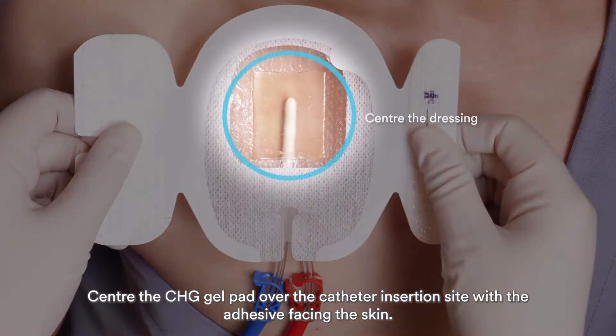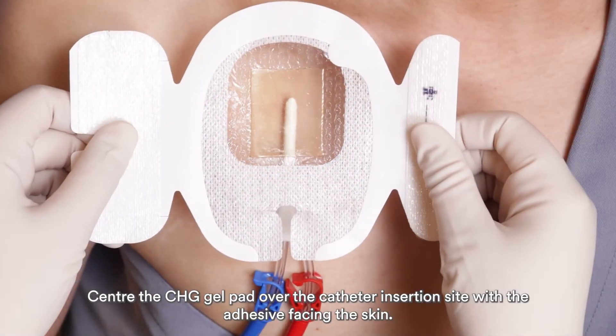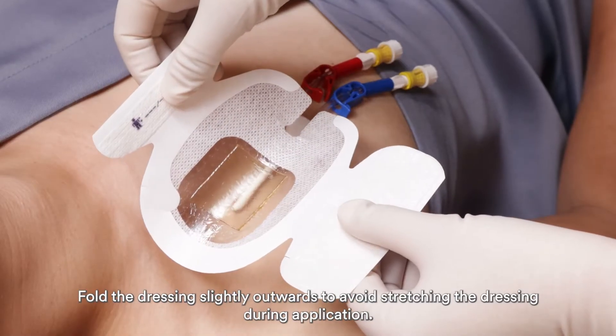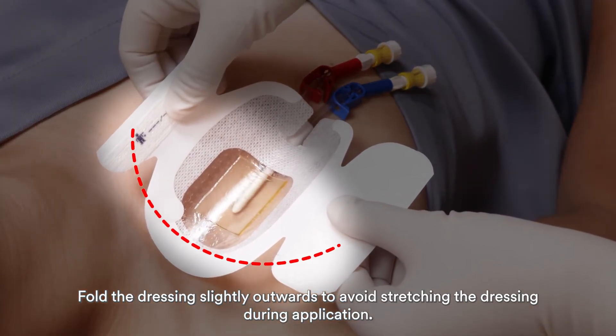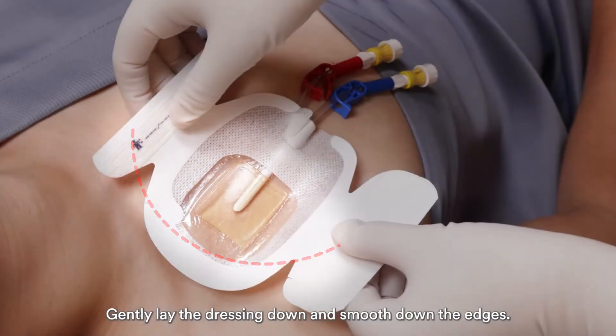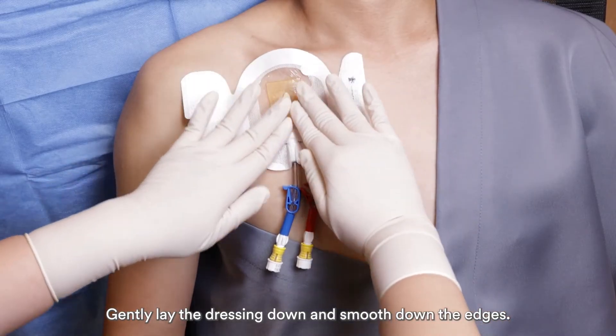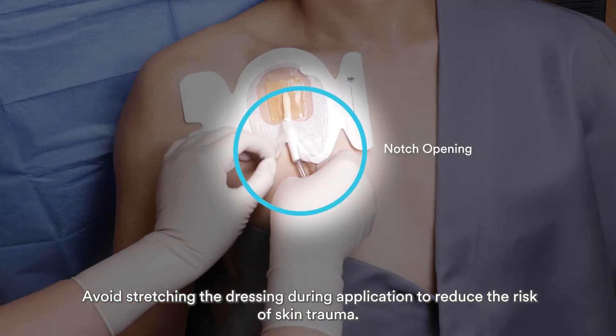Peel back the liner from the dressing to expose the adhesive surface. Center the CHG gel pad over the catheter insertion site with the adhesive facing the skin. Fold the dressing slightly outwards to avoid stretching the dressing during application. Gently lay the dressing down and smooth down the edges.